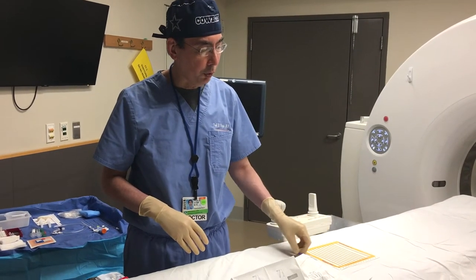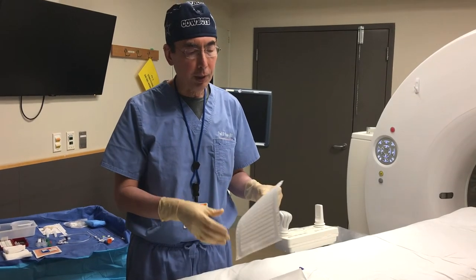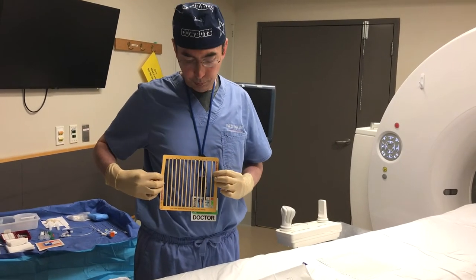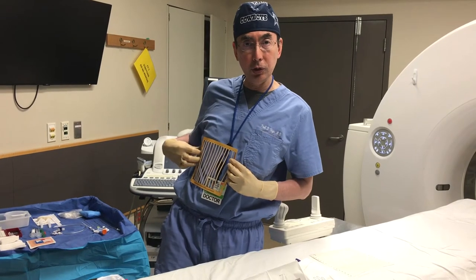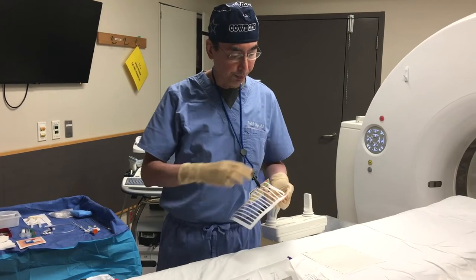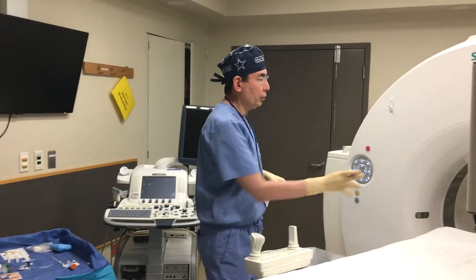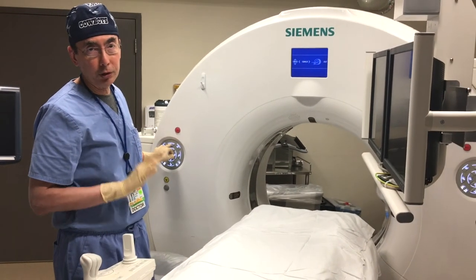One of the first things for a CT-guided procedure is we use a grid to localize the area we're going to enter. You peel this sticker off and the grid lines go vertically along the patient's body. When they're in the scanner and we get a cross-sectional scan, we see the dots on the skin surface, which marks the grid line where we want to insert the needle. To mark the skin, we use these purple markers supplied in every room. This top button on the control panel turns on the laser light.